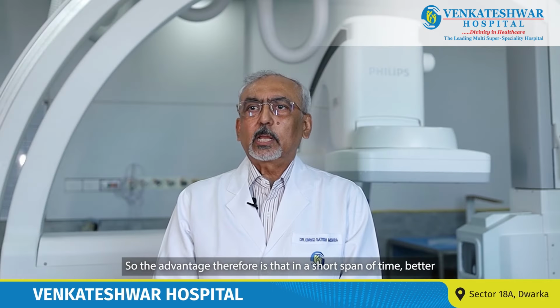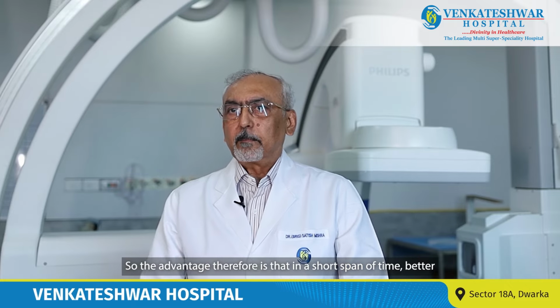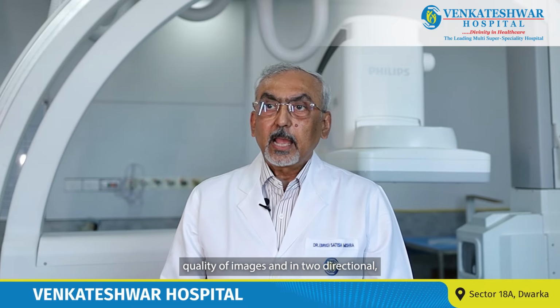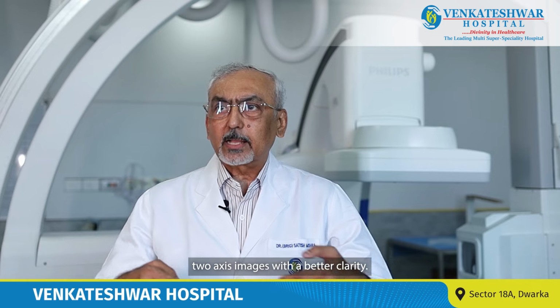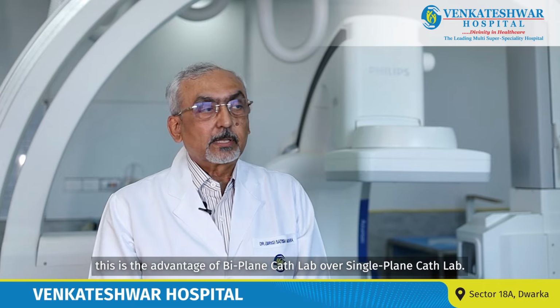biplane cath lab. So the advantage therefore is that in a short span of time, better quality of images, and in two-directional, two-axis images with a better clarity. So gentlemen, this is the advantage of a biplane cath lab over a single plane cath lab.